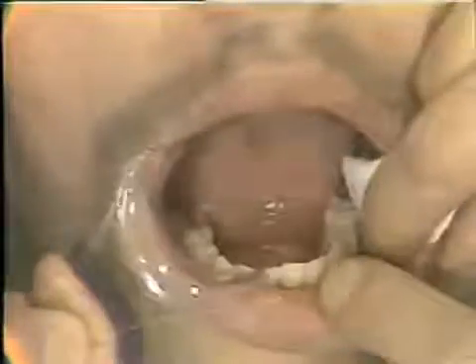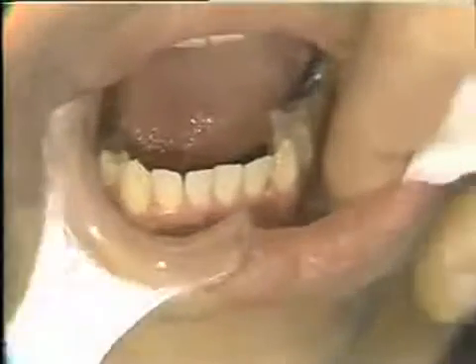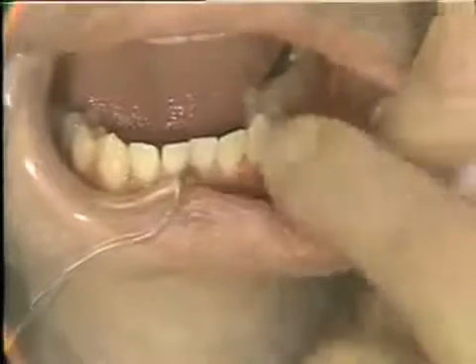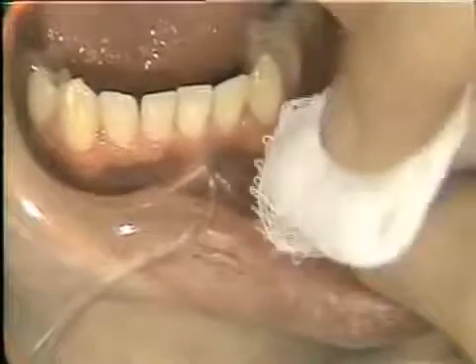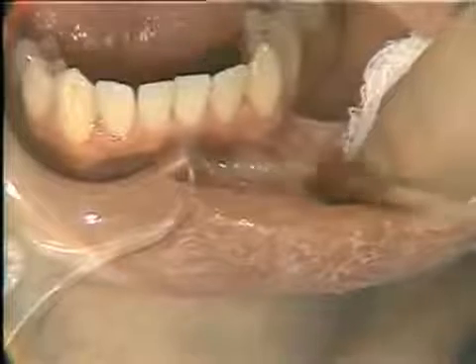All right, let us demonstrate infiltration of the lower cuspid tooth. We just have them open partially till we get our retractor placed here again to throw a little more light in here. Now, you'll notice that as I retract Andy's lip here between index finger and thumb, I retract it out and upward slightly, how these tissues become quite tense here in the vestibule. You can see that quite nicely. And if we can keep them tense, again, we can pass the needle bevel through them with literally no discomfort. I'm going to dry the mucosa again in the conventional way, just laying my gauze pad there for a few moments. And then we'll apply a little betadine to our injection site.